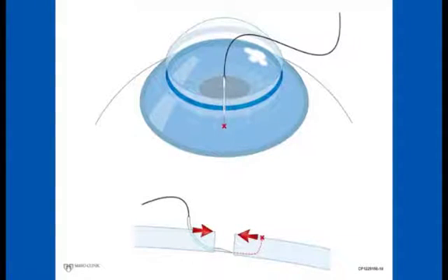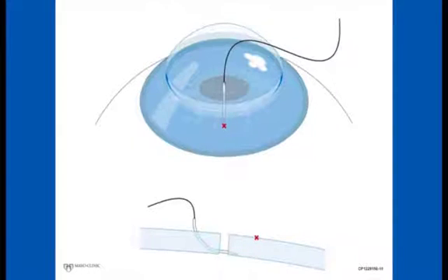The second cue is one can see the front surface of the graft become flush with the front surface of the host. As soon as you have that position, engage the needle into the host wound edge, but just a bit. Keep your gaze on the needle tip to make sure it remains stationary.